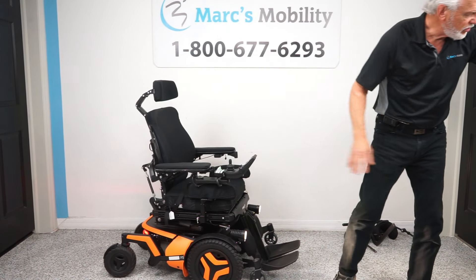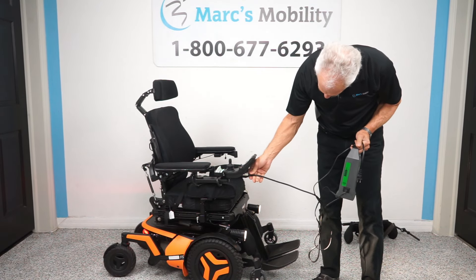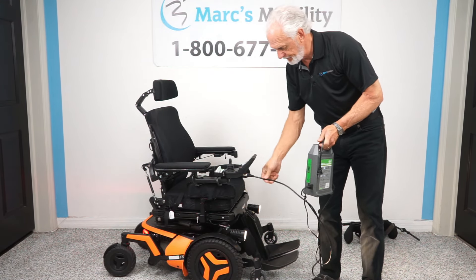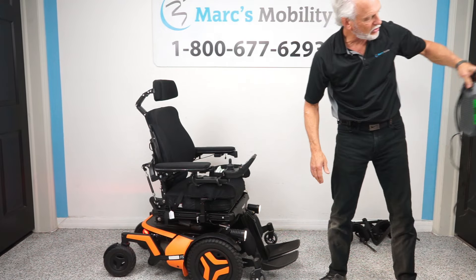When you charge this chair, you'll use your Permobil charger — plug it usually right below the joystick. As soon as it goes to full 100%, the batteries are full and the charger will cut off. These are smart chargers. We'll send you a charger with the chair.